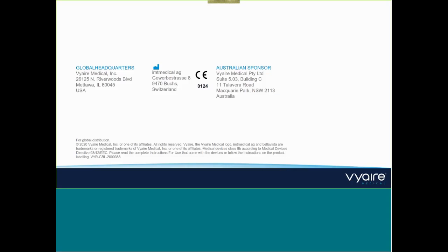And if you use Sidestream and have leakage during exhalation, it's the same as in non-invasive ventilation. You will get some CO2 level, and if you are able to keep the leakage constant, you might get information out of it. But that's one of the biggest challenges, that you can't be 100% sure how the leakage is. So trending will be difficult, because you never know where you came from.